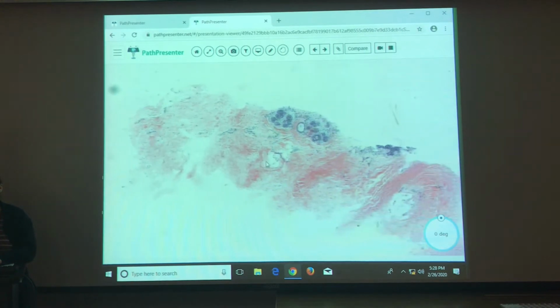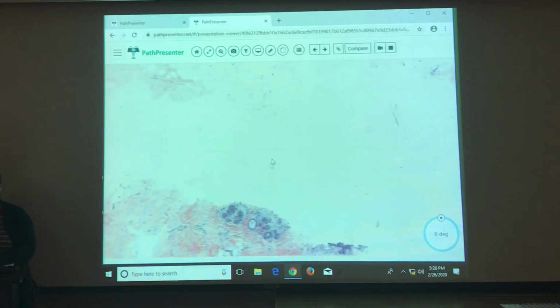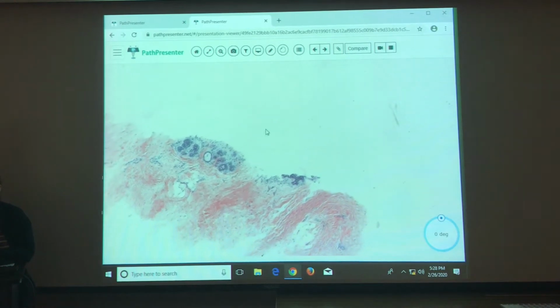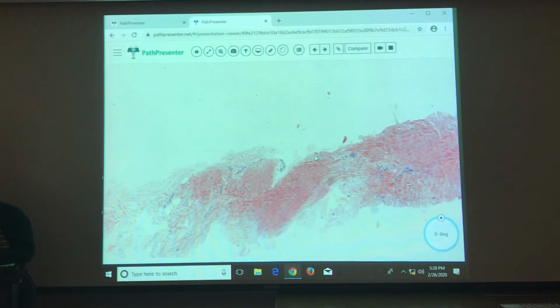Is anything jumping out at you or not really? I mean, first impression, seeing some of those squished glands, if it was a younger patient, I would say fibroadenoma. It's a benign lesion, but 40-year-olds can also get fibroadenomas. True.